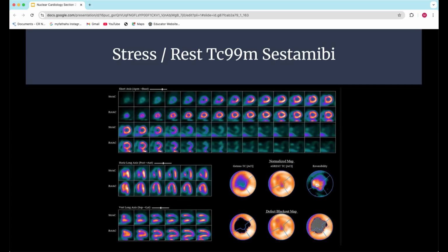And do you think that it's high up at the beginning of where the LAD comes out, or you think it's down further a little bit? I believe down further, maybe a little bit. Why do you say that? Sorry, I'm picking on you. No, you're okay. Just because the center of the circle is the apex, and the outer side is the base of the heart. So since it's not touching the base, it's closer to the apex. Yeah, exactly. You're noticing that you're getting perfusion at the base, so there's got to be blood flow coming partially down that LAD somewhere, right? It's coming down, but we don't know for sure.